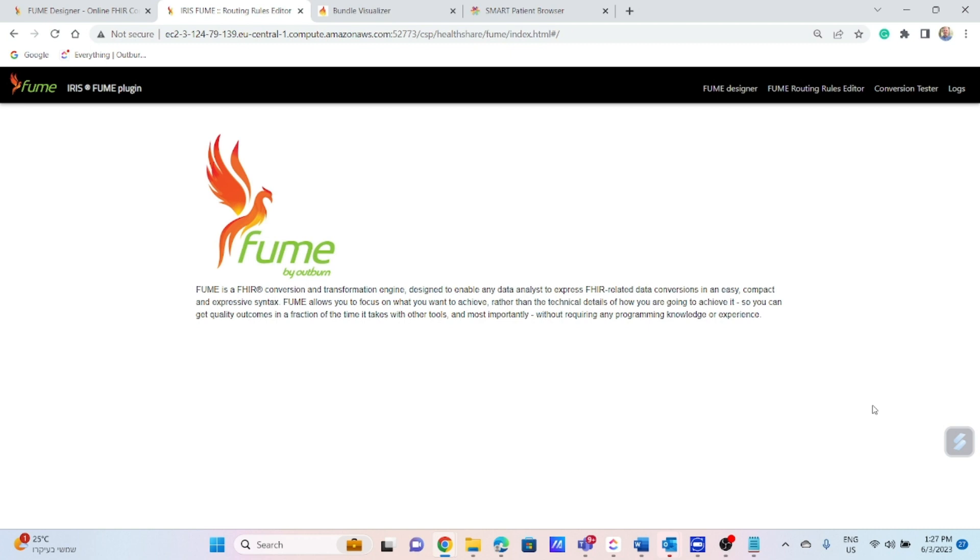I will focus now on demonstrating an integrated solution of FUME with Iris for Health platform that enables you to transform the HL7 V2 message into FHIR resources which are conformant to valid profiles. In the frame of the current demo we will see an ORU message transformation.